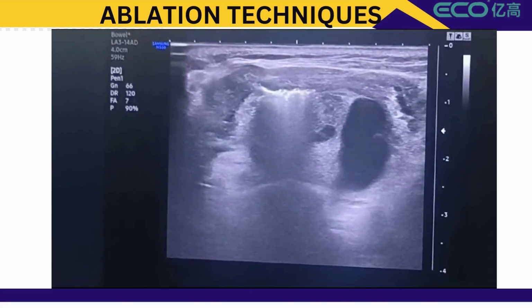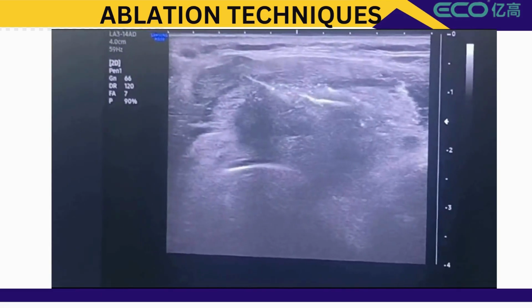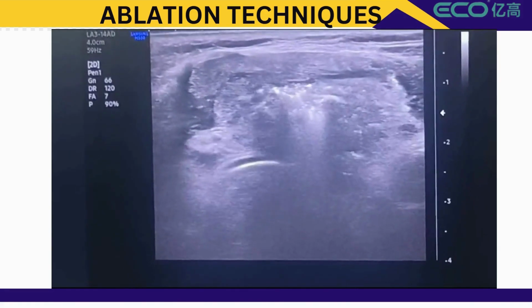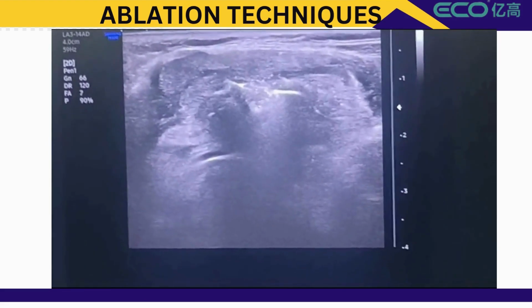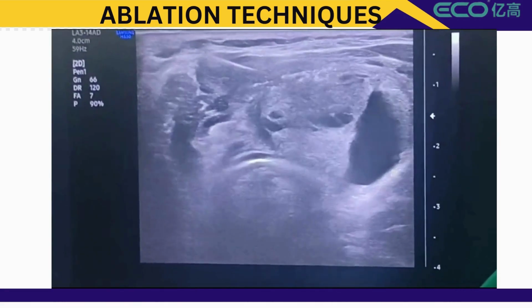Prior to this you can aspirate, but it causes intracystic hemorrhage. That is a very recurrent problem, as are abscess and intracystic hemorrhage, and it is difficult. So what we prefer is to ablate around the cystic nodule first. This will cause ischemia. All the bleeding vessels or feeding vessels will be ablated. So this is the new technique we do.